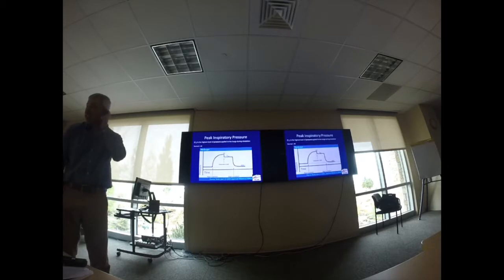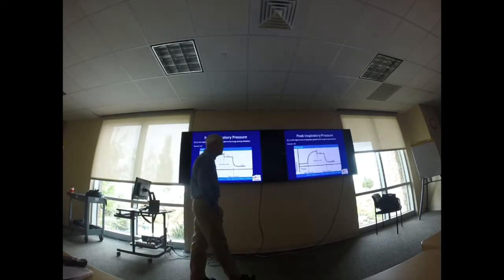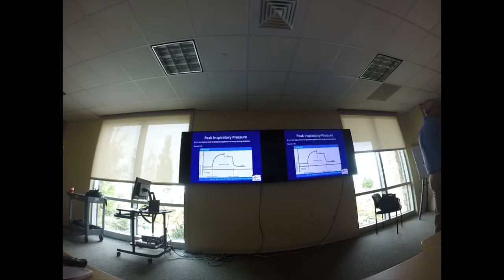You're suctioning that mucus plug out, or they're coughing it up, or whatever, right? What else could cause an increase in your peak inspiratory pressure? Anything that would affect the stiffness of the lungs, so pneumo. Okay, and pneumothorax could cause an increased peak inspiratory pressure. Anything else you could think of? Kinked tubing, yeah. So somebody's got their foot on the circuit, or the endotracheal tube is kinked. Somebody coughs, they're waking up, pain, anxiety, agitation, coughing. They're trying to breathe against the ventilator, right?